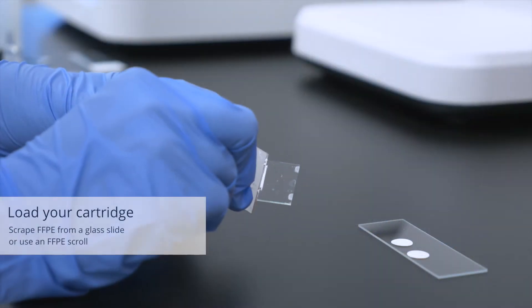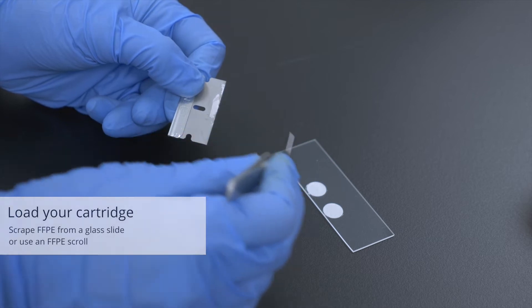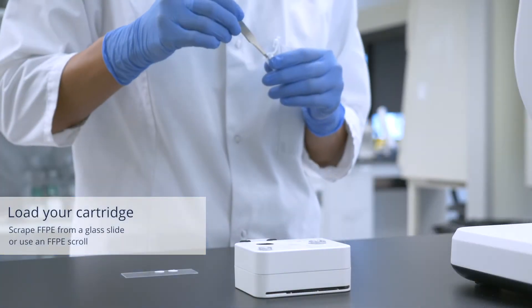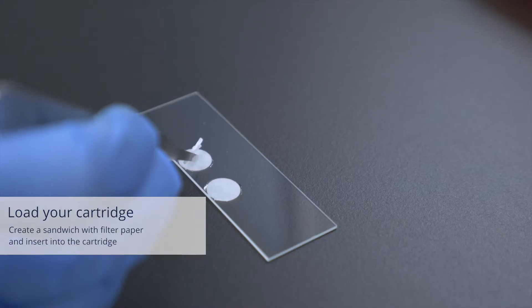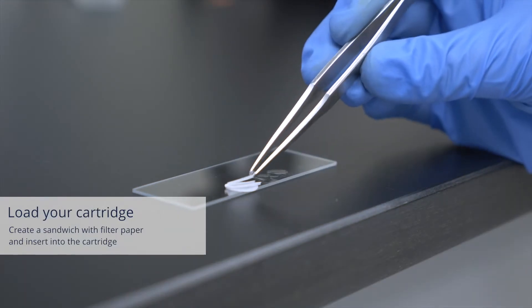To run a test, either scrape an FFPE section from a glass slide or use an FFPE scroll. Simply place your sample on a piece of wetted filter paper, create a sandwich, and place the sample inside the cartridge.